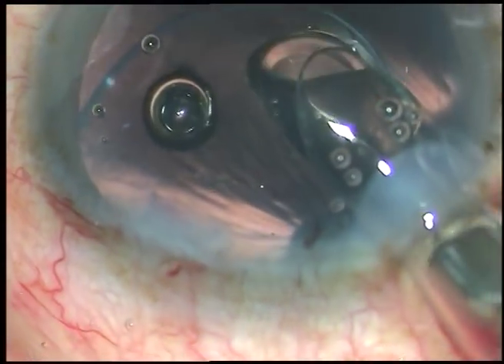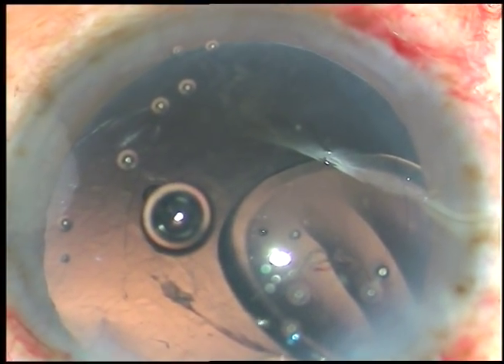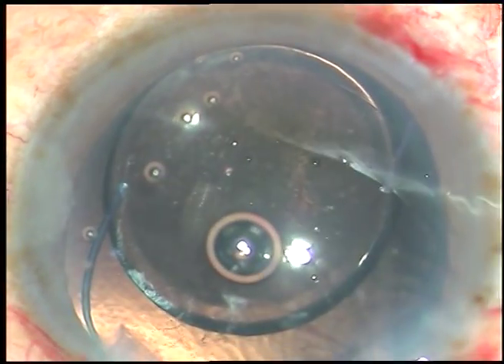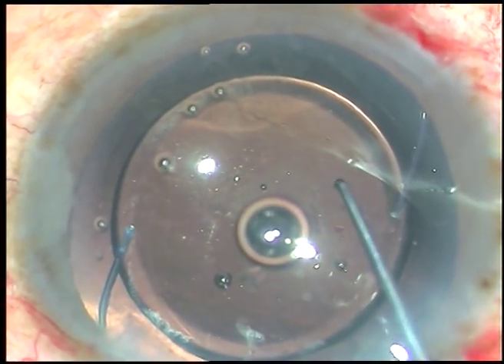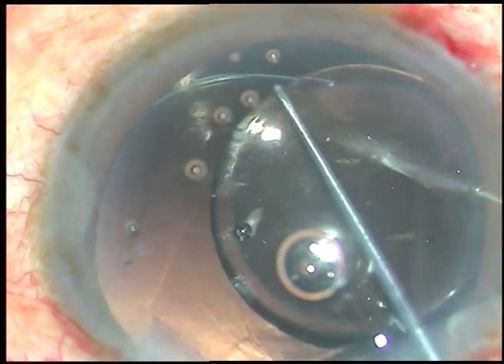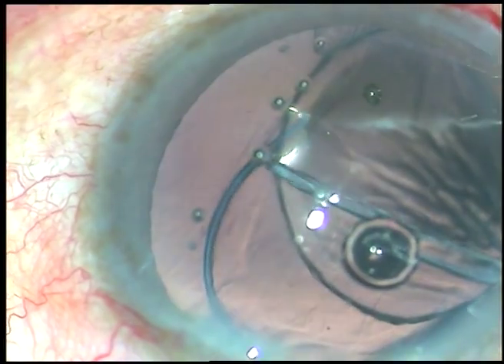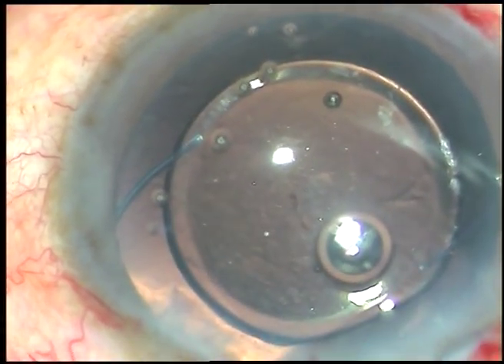The trailing haptic went into the capsular bag but then came out. I take a McPherson's forceps, hold the trailing haptic, and place it into the capsular bag — here it is, the trailing haptic has gone into the capsular bag. Now I dial the lens. I find that the leading haptic has come out of the capsular bag, so I am going to dial it back into the capsular bag again. Here it is — the haptic has gone in. Now both haptics are in the capsular bag.